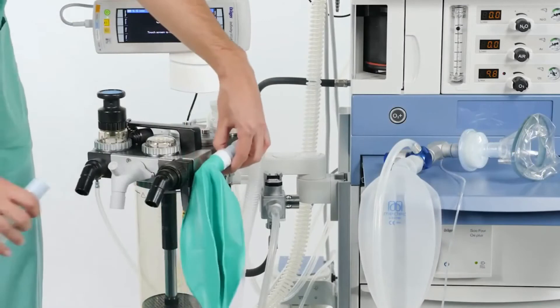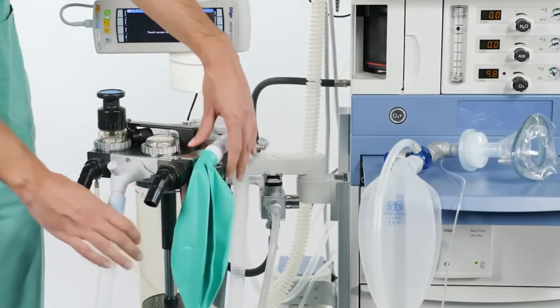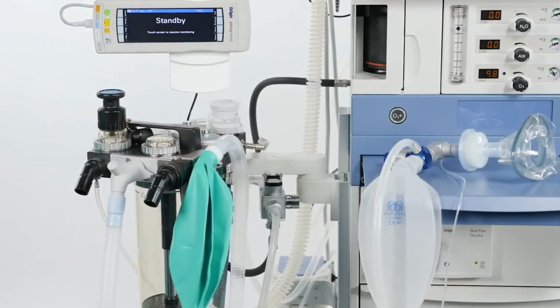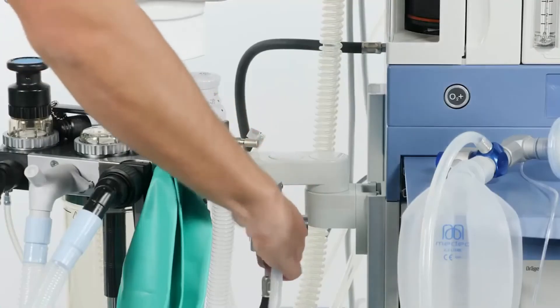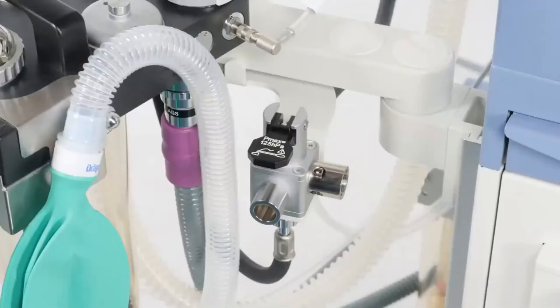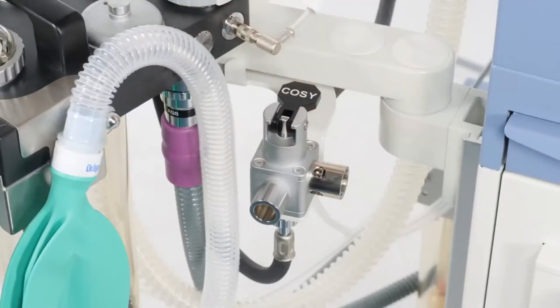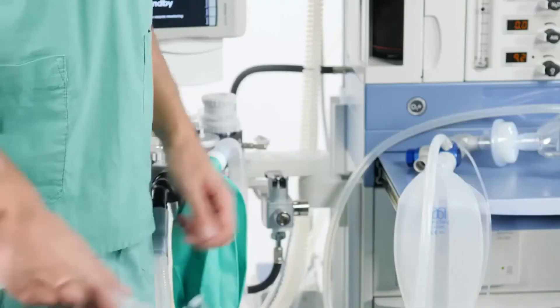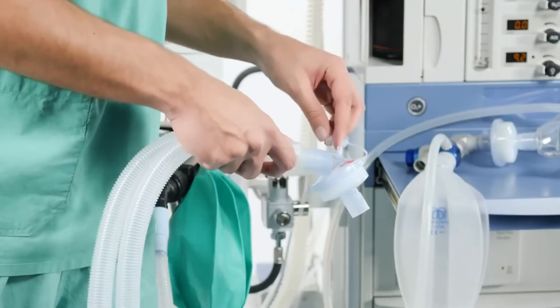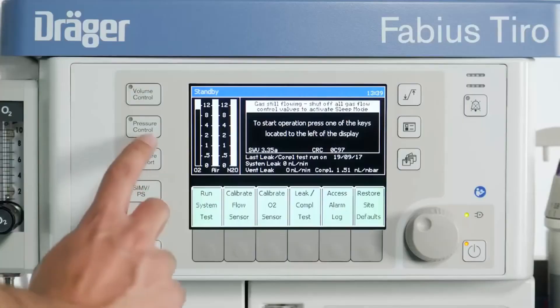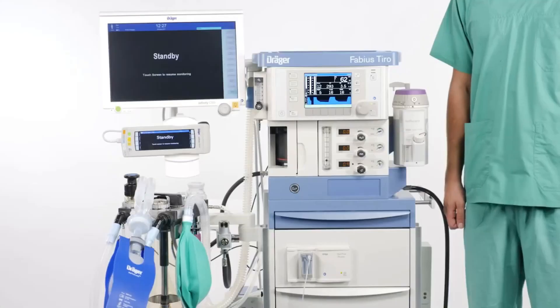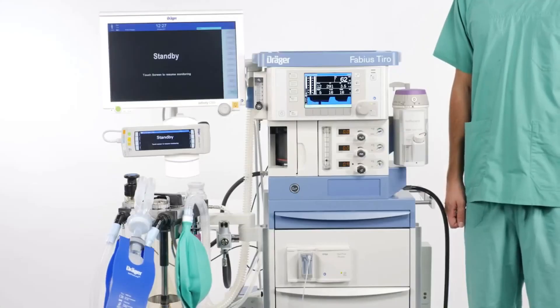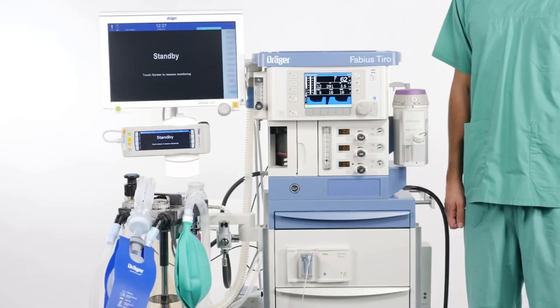If you want to mechanically ventilate the patient using the Fabius ventilator, use a suitable breathing circuit to connect the patient to the breathing system. Place the ACGO switch back into the COSY position, reconnect the sample line, and select and start a spontaneous or mechanical ventilation mode. Please follow these instructions when using the auxiliary common gas outlet on your Fabius anesthesia device.